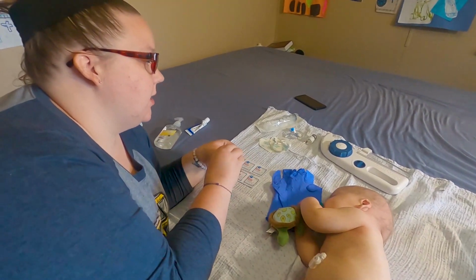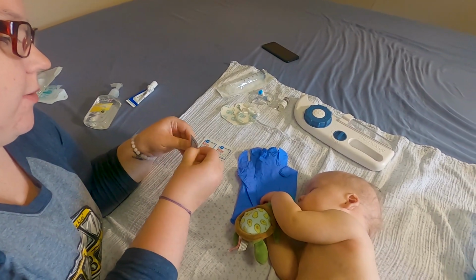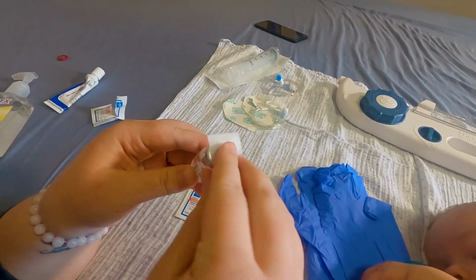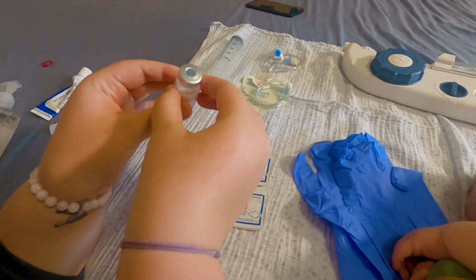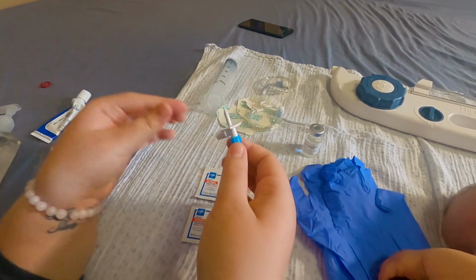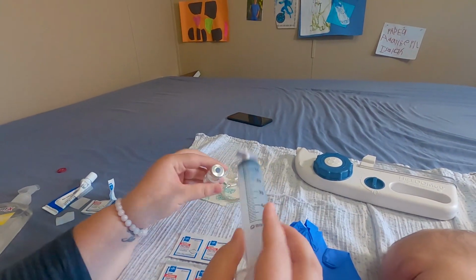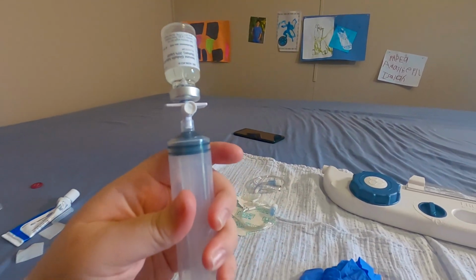We sanitize. So my hands are clean. We're going to open up our alcohol wipes and we pop the top and then we clean this part. Okay, so we make sure it's really cleaned, really good, and then I'm going to let it dry. This is our spike, so we're going to open that up and do this. Okay, so it should be dry now. We just stab it.